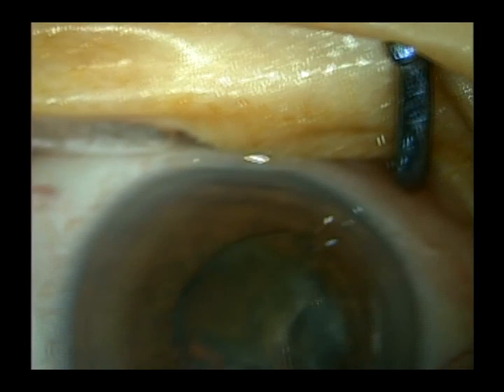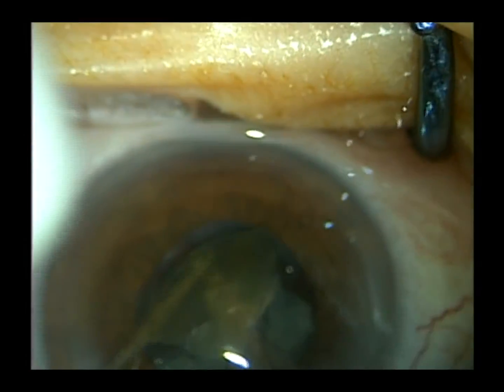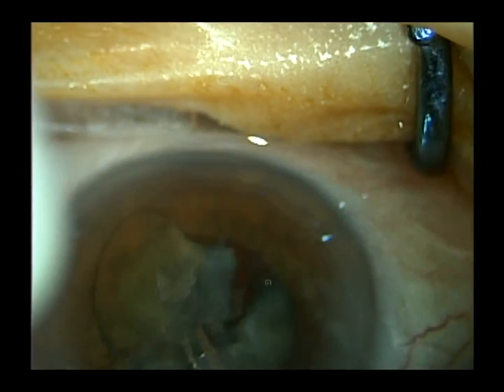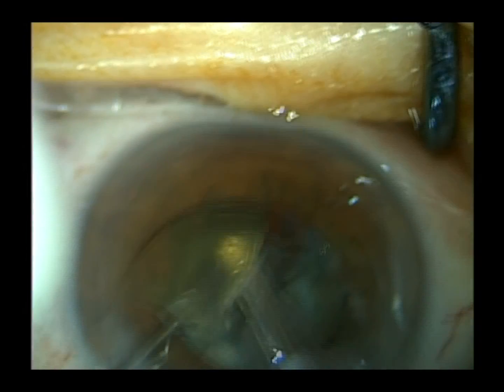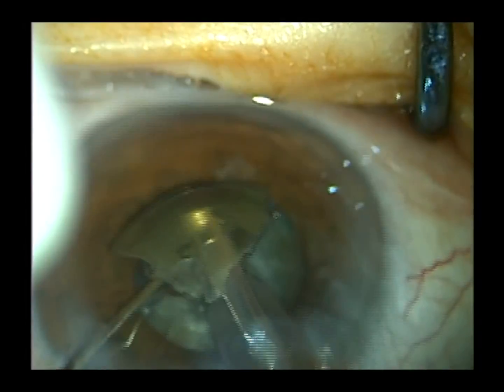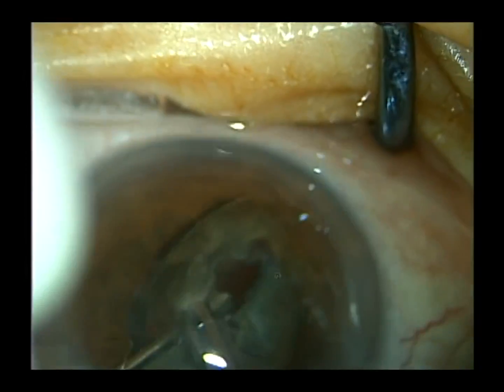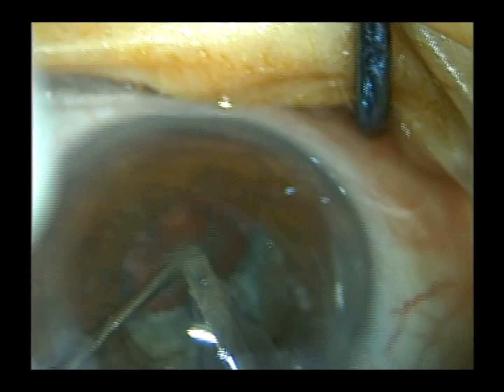I try and keep all my instruments in the center of the eye, in the visual axis. I try not to chase after any lens material that is out in the periphery. I just try and bring all the lens material toward the middle of the eye where it's safe, so I reduce my chances of engaging the anterior capsular rim, the posterior capsule, and the iris.